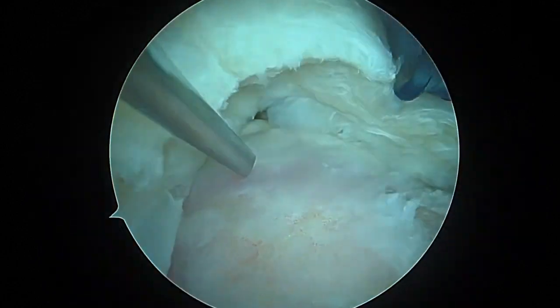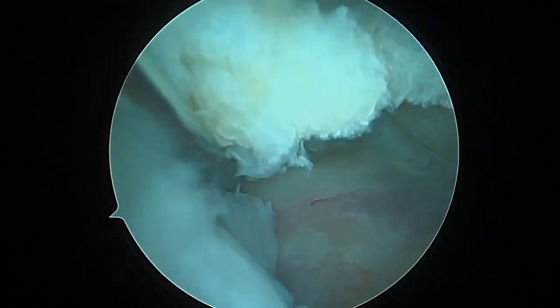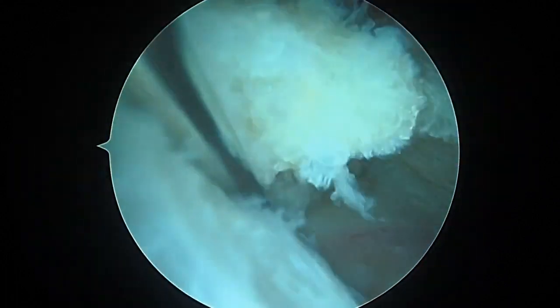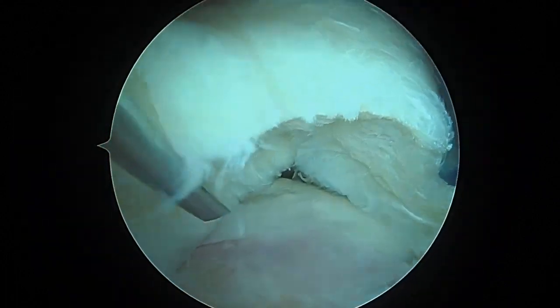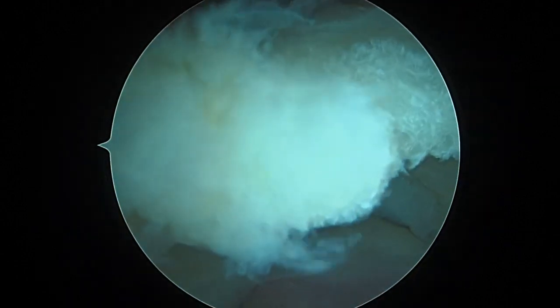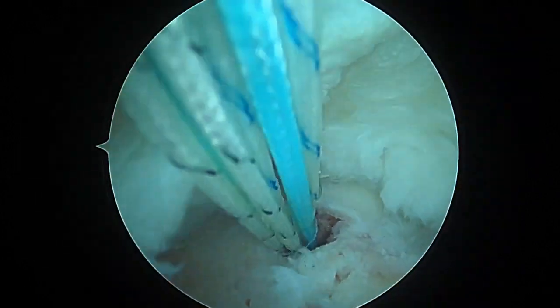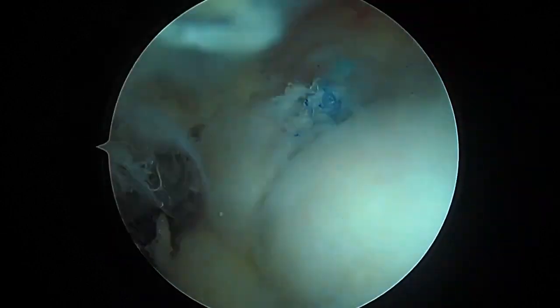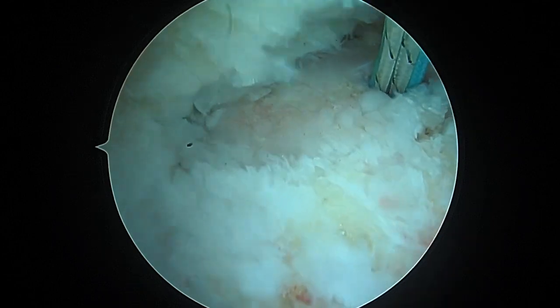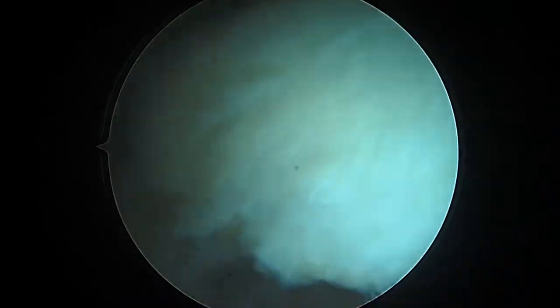With these large tears we often have to internally rotate to make sure we're getting even more posterior, which is to the left on the humeral head. When I internally rotate, you can see the ball rotates to the right — that gives me an anchor that's a bit more posterior. There's the second triple-loaded all-suture anchor in, right at the articular margin. The first one we've tied completely using those sutures as ripstop stitches. Now we're going to tie the second three — we're going to pass them first and then we'll tie them.